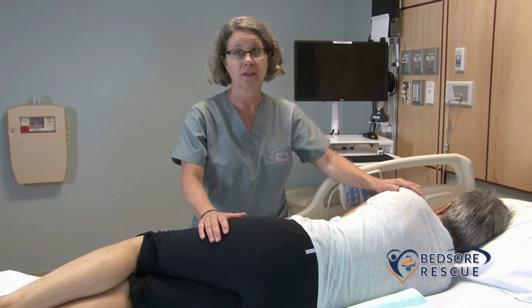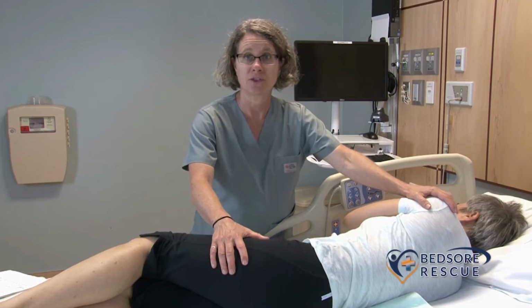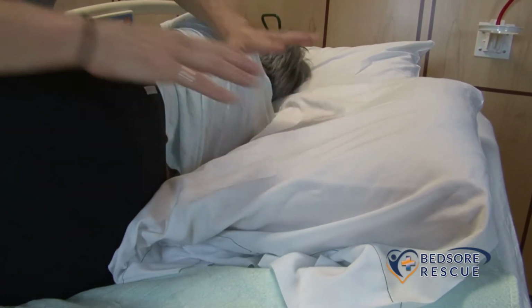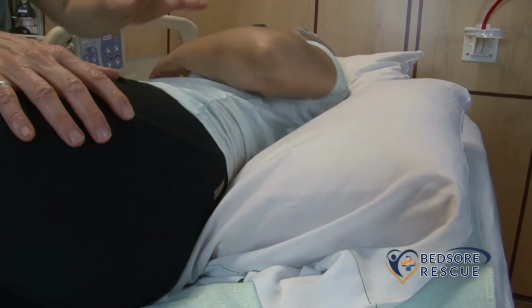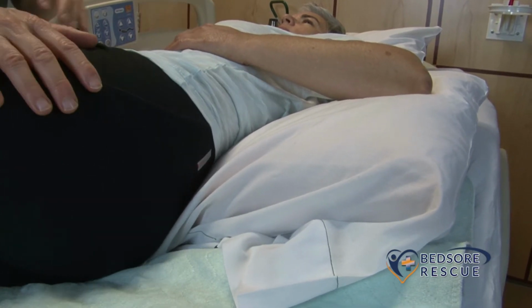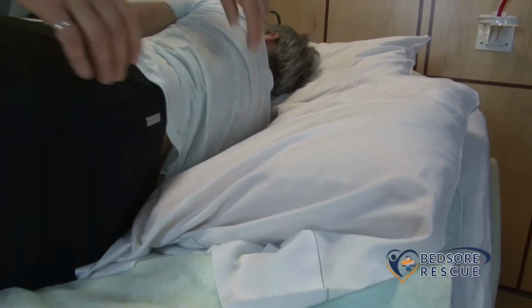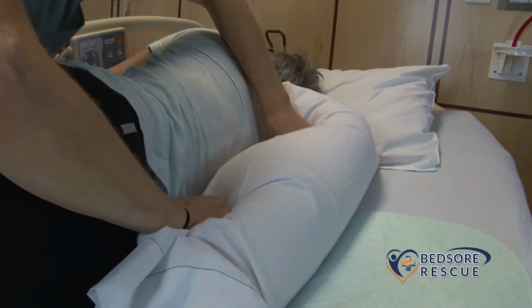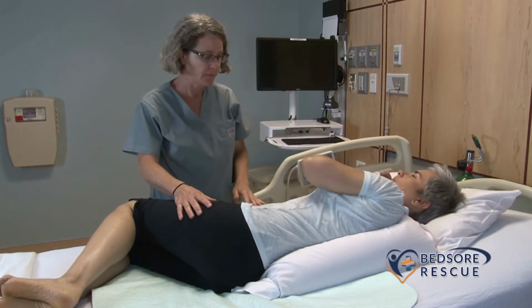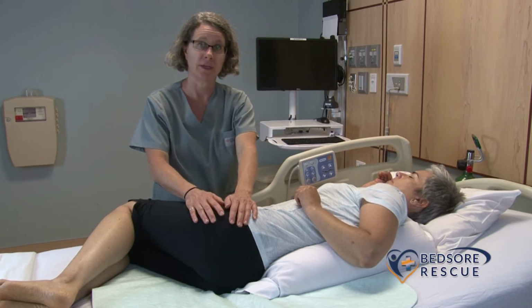The tricky part of turn therapy is not so much assisting the person to turn, it's keeping them near this 30-degree angle. You can try using pillows, which work for a little while, but pillows have a tendency to squish down over time, and the person ends up right back on their sacrum in no time. Some people like to fold the pillow in half, which is a little difficult to do. Certainly gives you a better lift, but I don't think we have the 30-degree angle anymore. As a matter of fact, I think she's on her greater trochanter again.